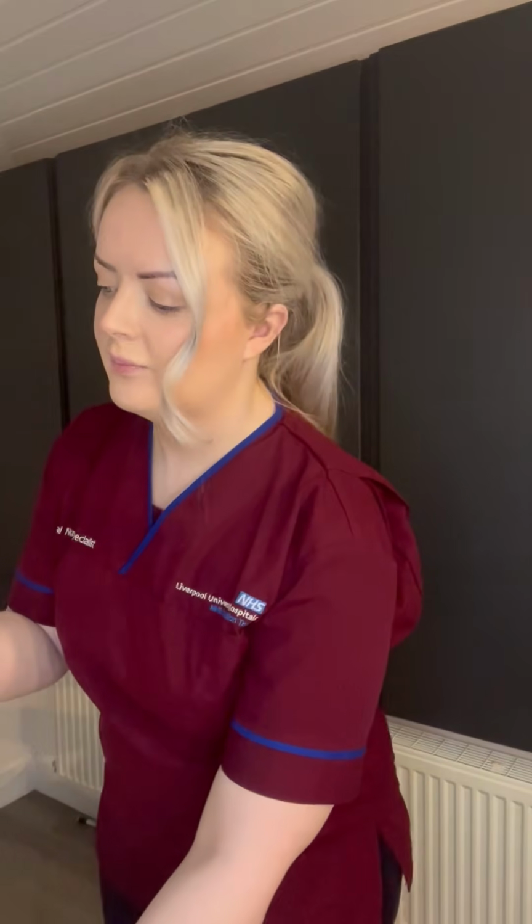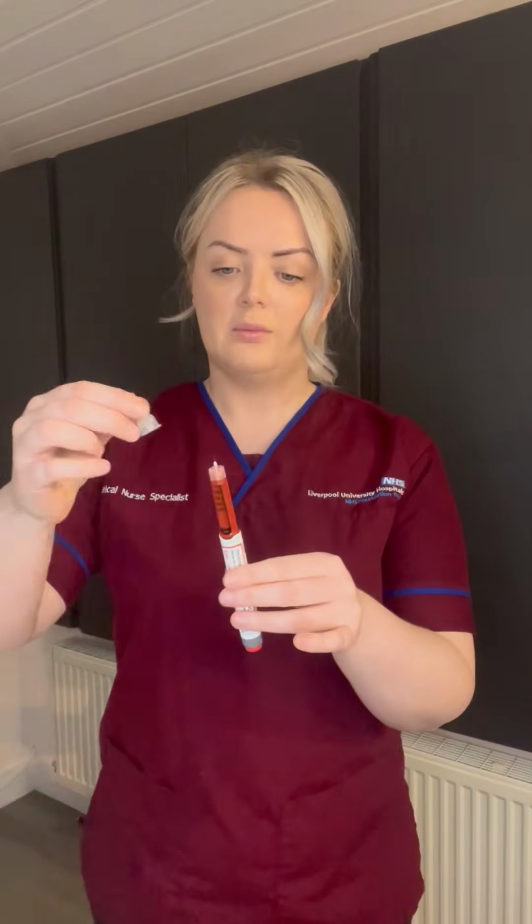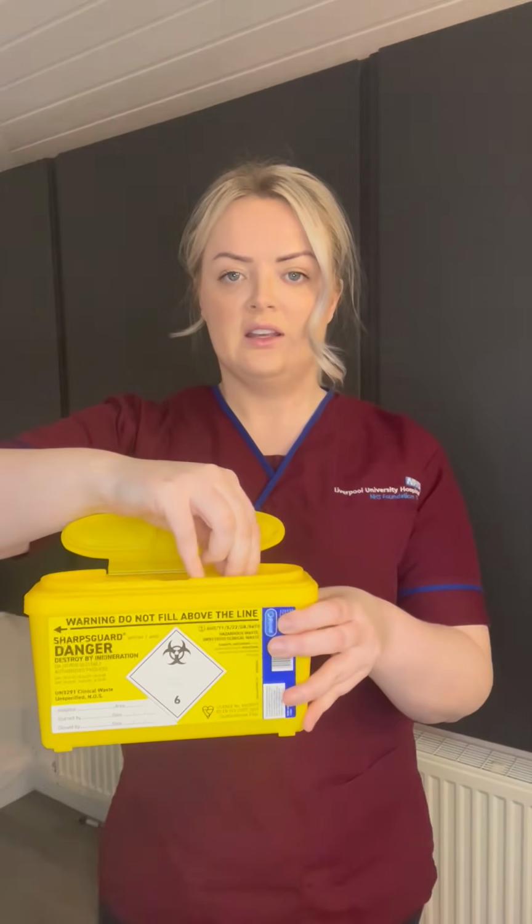We would remove it. As you can see, that needle is still exposed as it's a non-safety needle. So then what the patients will need is their own little sharps bin, which should be at the end of their beds or available to them when they're administering. They can apply the cap back on and screw it off of the pen and dispose of it as such in their sharps bin.